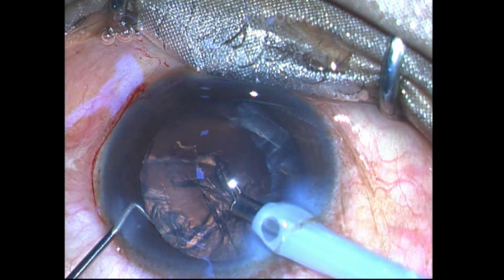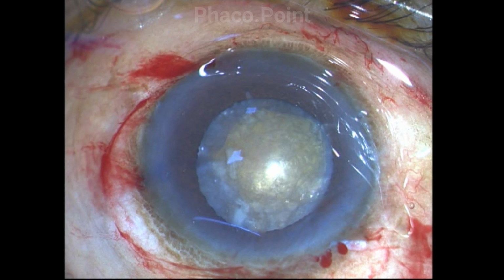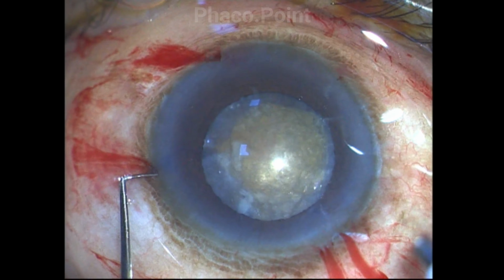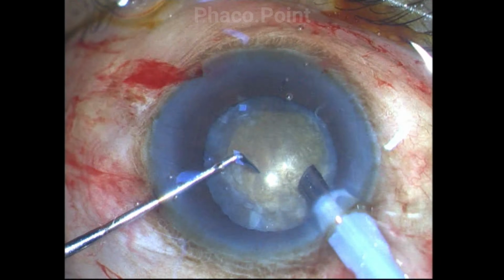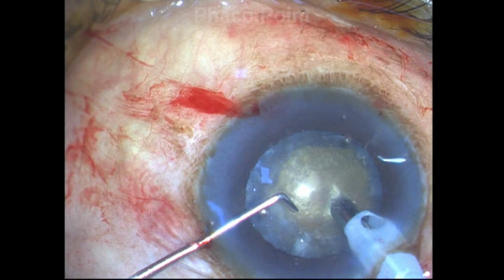Let's now look at this grade 3 to 4 hard cataract. The surgeon uses enough viscoelastic, preferably a dispersive one, to protect the endothelium, because despite the power modulation, you're going to require some more energy here. The sharp chopper is introduced first, lying on its side, and then the phaco probe with the best tip they have, with a slightly more exposed tip, is introduced, and the surgeon proceeds with chopping.